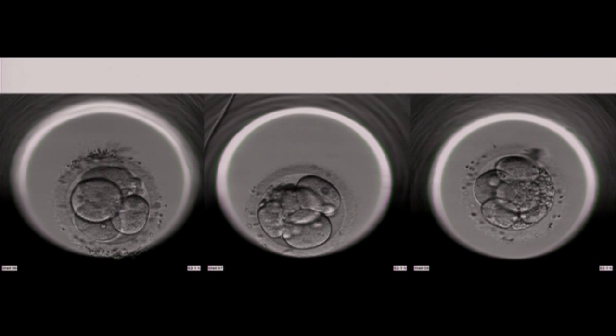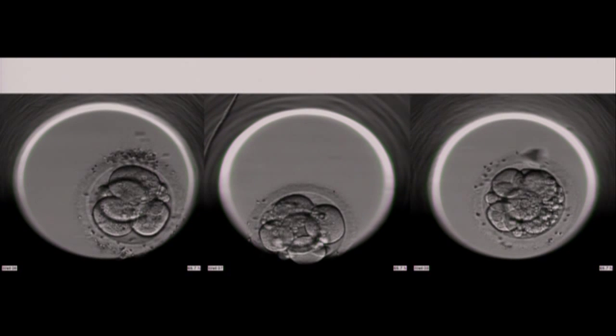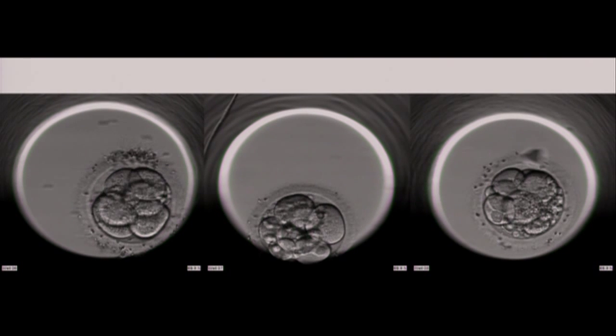And you'll see here 3 embryos that look very similar. Maybe right now if I looked at them and I was doing a static assessment, I'd come to a different conclusion than I would if I actually had all the video information. So if I looked at them now, I might pick embryo number 3, the one on the far right, as the one I would put back to the patient. But if I looked at the whole video, I would see that each of these embryos had a different way of getting to where it was at that particular time.